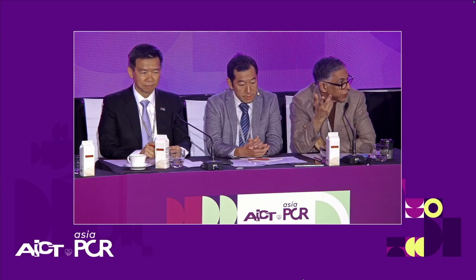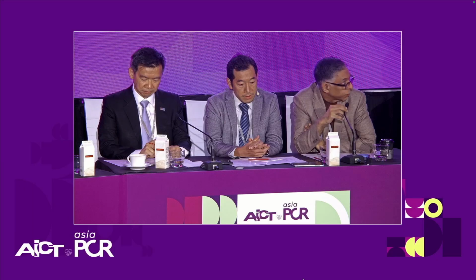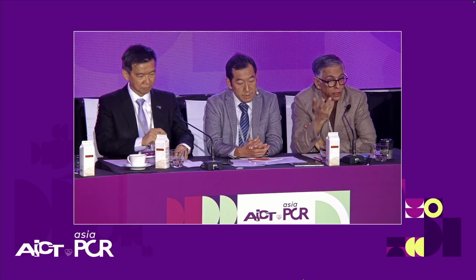It is important to be aware that the randomized data, the ROTACUT trial, was a negative trial, but what they did is they used 1:1 cutting balloons at low pressure. And so perhaps the pressure may modulate the response to cutting balloons. Yes, I agree with that because, like I said, the IFU said low pressure, but when I go high pressure, I think I see better results sometimes with imaging.